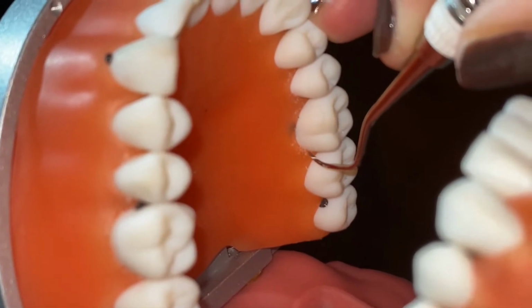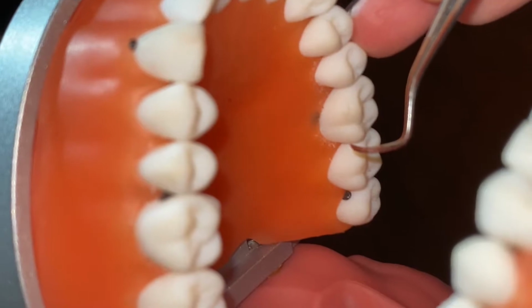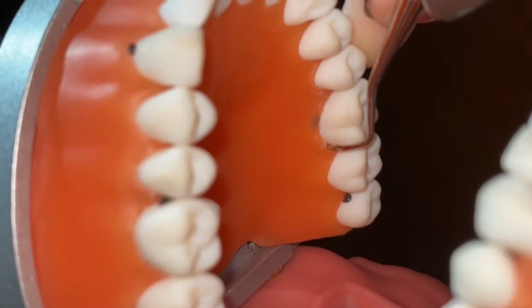Starting again with that 0 degrees on the surface of the tooth to insert below the gum line, opening it up.